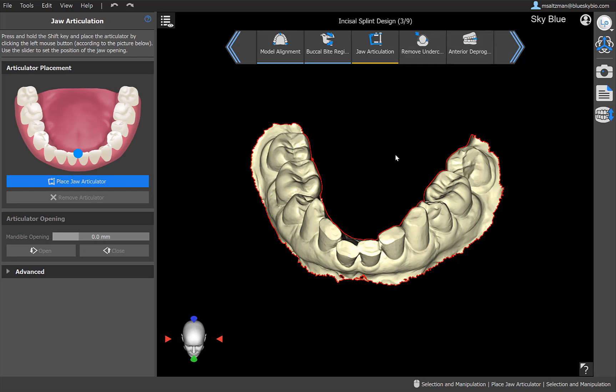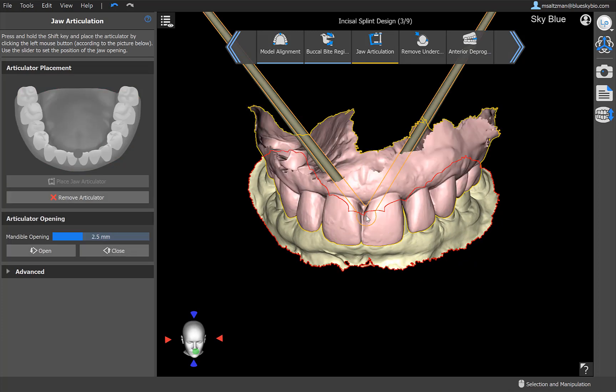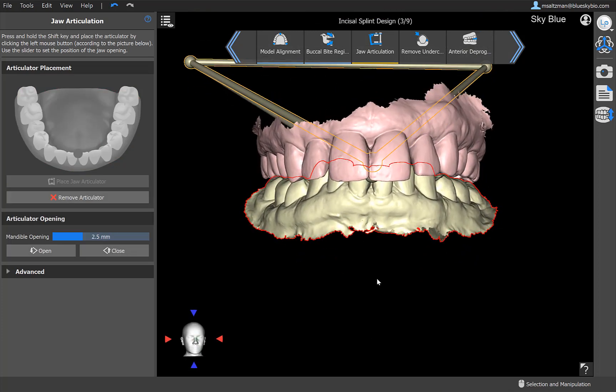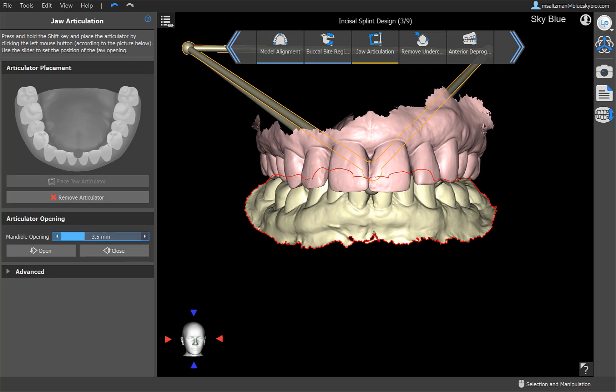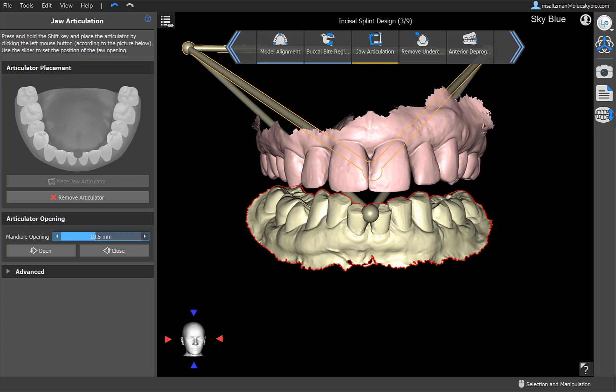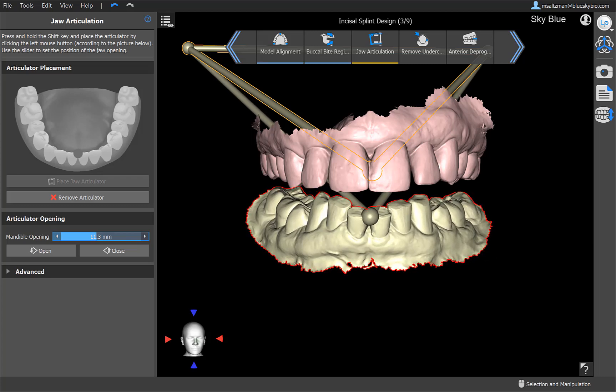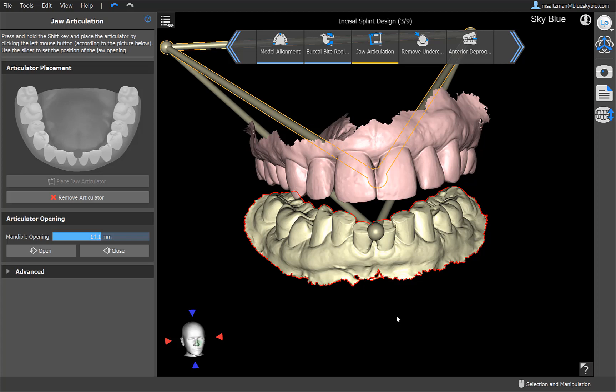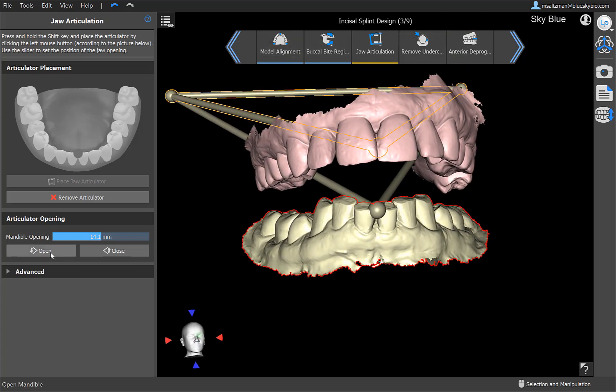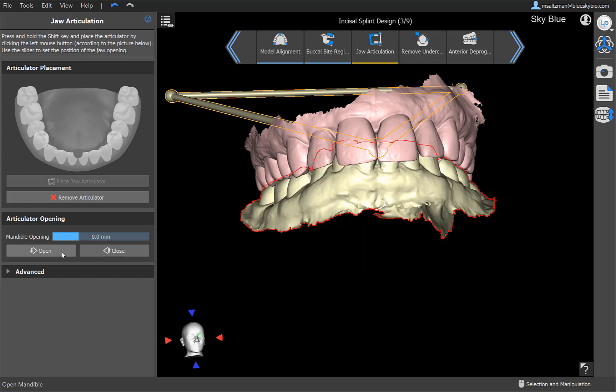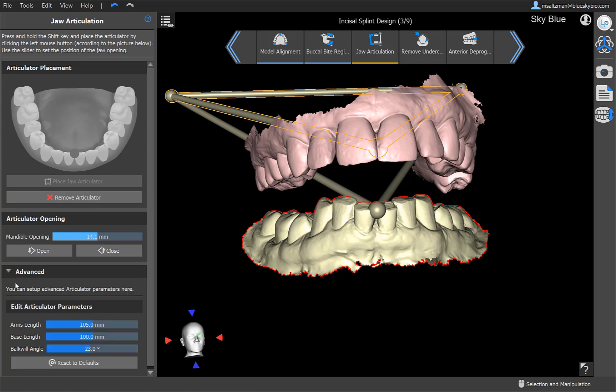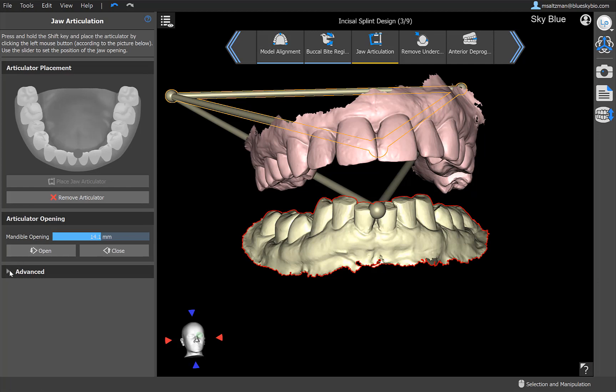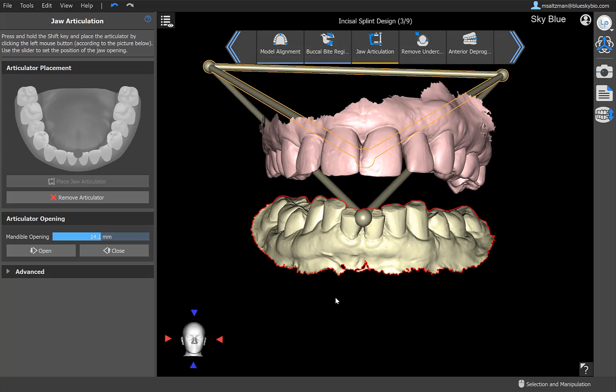Our next step is to place our jaw articulator. Simply mark, and again, marking is by shift and the left mouse button click, and the articulator is placed. You're able to open the jaw simply by increasing the mandible opening. This is important, especially if you're going to be creating a splint that goes to the cusp tips of the opposing arch. So this will be based on the opening between the two different jaws. Of course, you have the ability to close and to open to the opening that you did previously. You could remove the articulator and replace it. And then we have a lot of advanced settings in terms of the arms length, base length, the Balkwill angle, and other functionality there. So once we have our jaw open to the desired opening, go ahead and click on next.